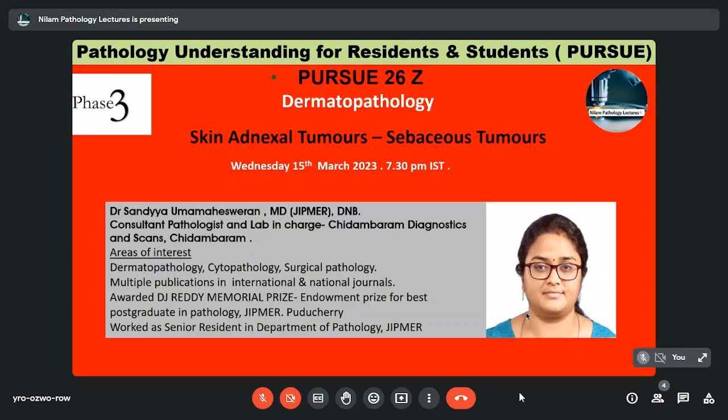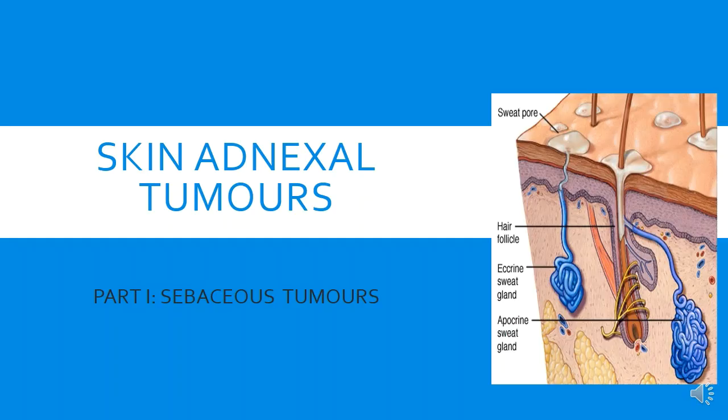She's also worked there as a senior resident. And today, Dr. Sandyya will be talking about skin adnexal tumor. This is the first lecture on the skin adnexal series of tumors, and this will be on sebaceous tumors. Over to you, madam. Thank you so much. A very good evening to all. Today I'll be talking about skin adnexal tumors, focusing particularly on sebaceous tumors.